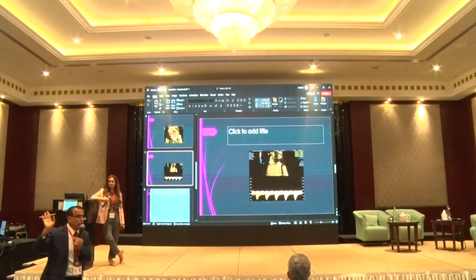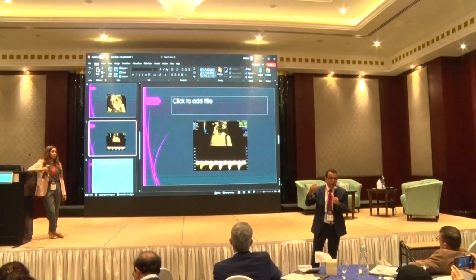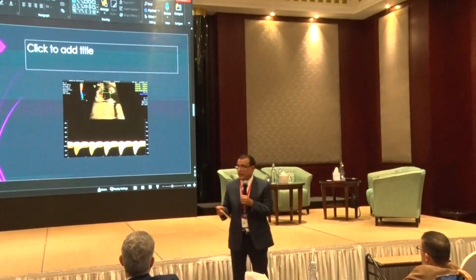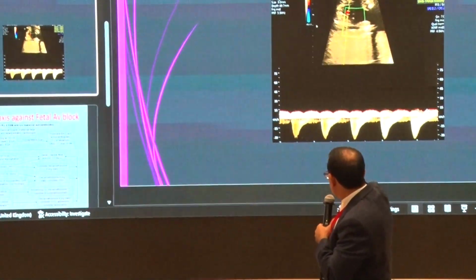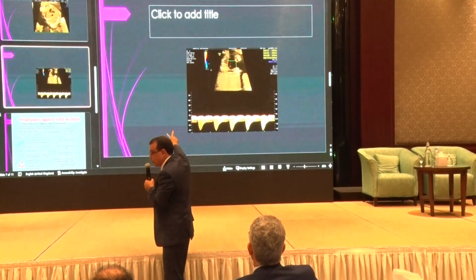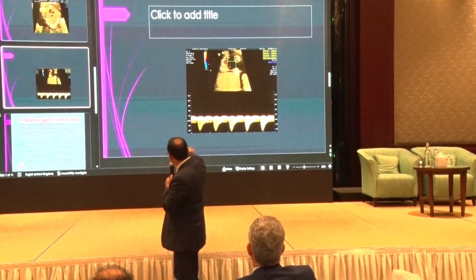What are we looking at in the cardiovascular profile? That's how we, as cardiologists, evaluate the heart, and we say the heart is doing good or the baby can survive. Don't worry about it, Dr. Muzib. We grade it from 1 to 10. So we look at this. It will give you 1 point, not 2 points. Actually -1. If it goes all the way to the bottom, that will give you -2. Okay? So the arteries are okay.